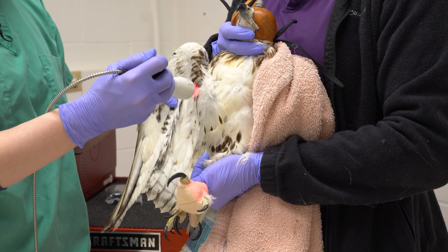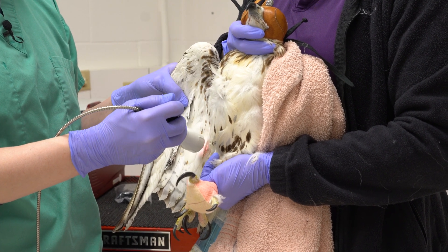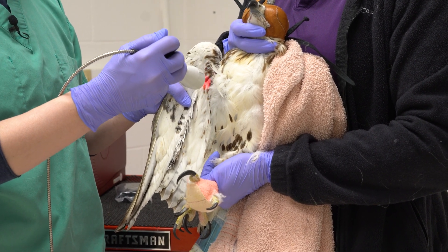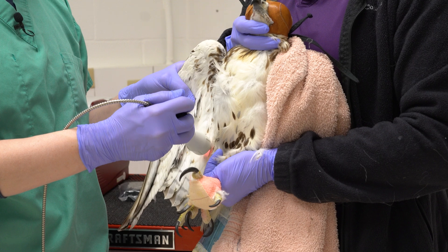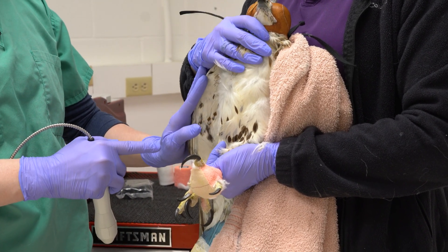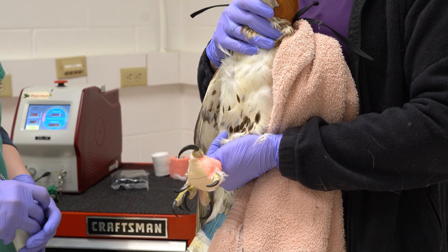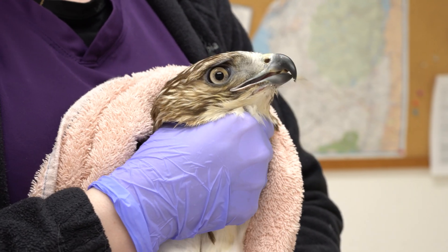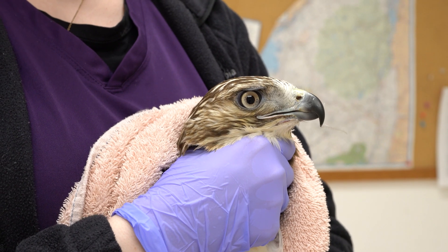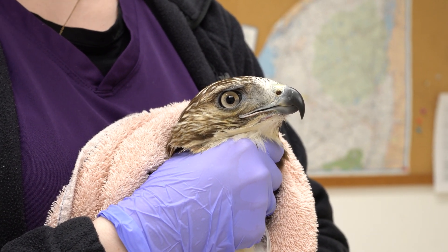With the class 4 therapeutic laser, the patient should be hooded or their head covered with a dark towel to protect their eyes. All wild birds experience some degree of stress in captivity during treatment; hooding and being handled by a trained technician can reduce this. The treatment protocols suggested here should always be balanced against the stress of handling in each patient, and care should always be taken to prevent further injury during treatment.